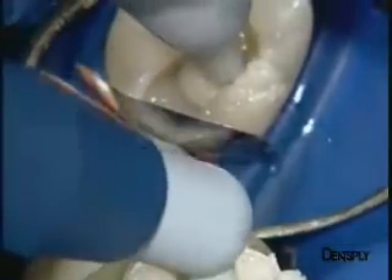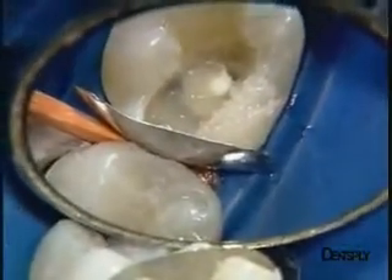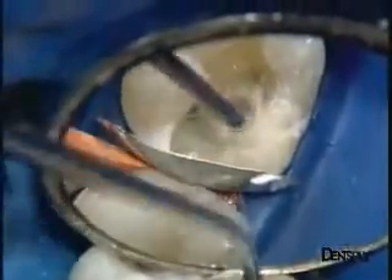We place a last layer of Ceramix Mono at the base of the cavity. Here you see how it is inserted using a completely smooth metallic plugger, which does not adhere at all to the composite material.